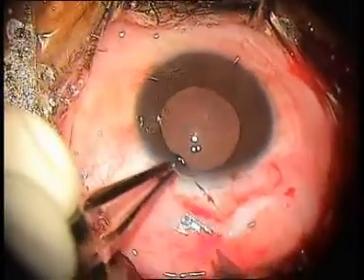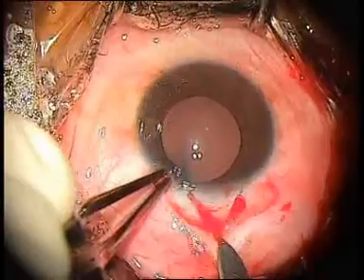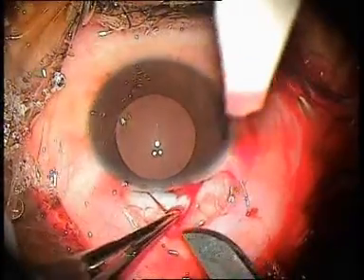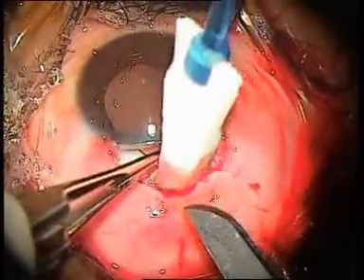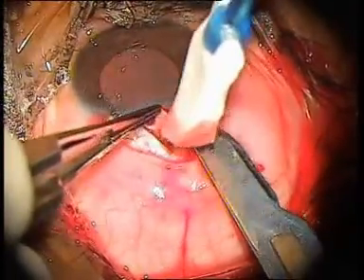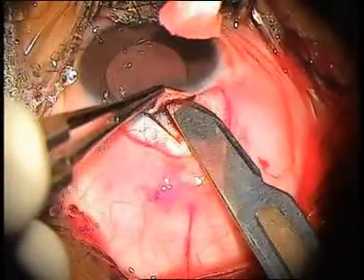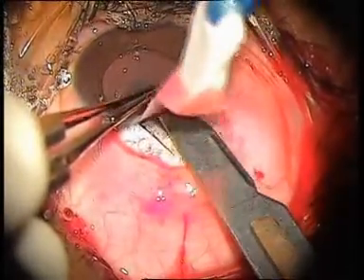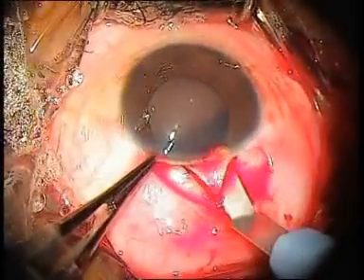A triangular incision is made adjacent to the corneolimbal junction and is deepened. A partial thickness scleral flap is raised and advanced carefully, avoiding buttonholing or tearing of the flap, until at least 1 mm of bluish grey zone of peripheral cornea is exposed. The section is widened with a crescent.